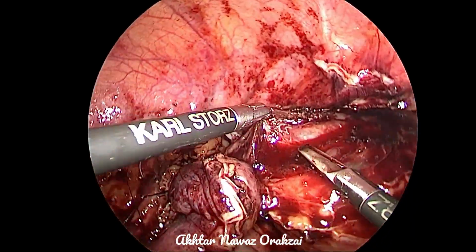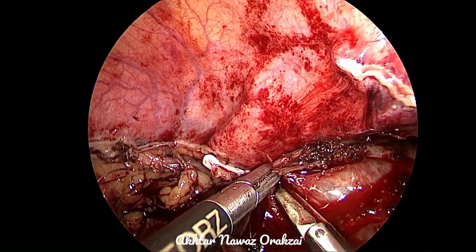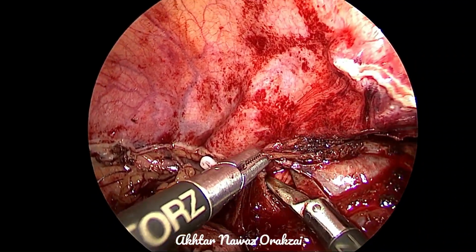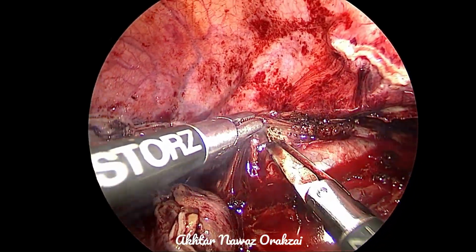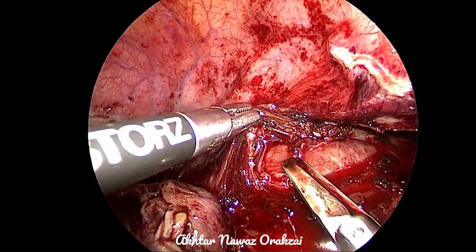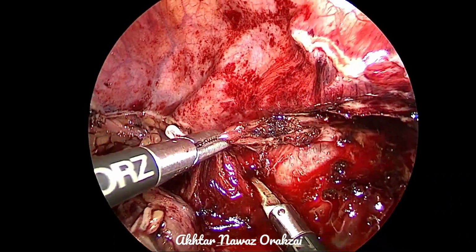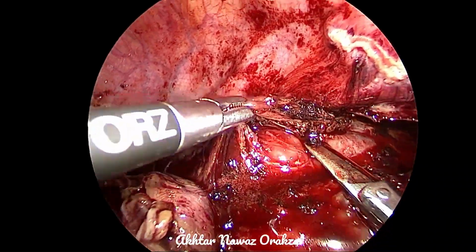This side of mobilization of the mucosa is easy, but the other side is a little difficult. For that, we have to grab the mucosa with the forceps and then do the dissection, but it really is difficult. It's not as easy as this wall is.